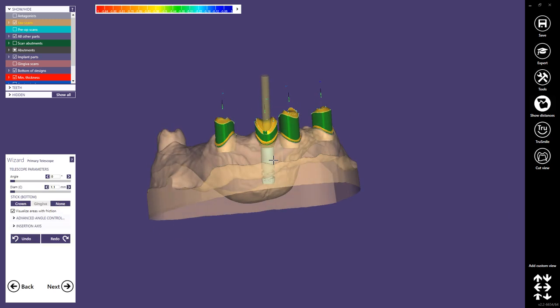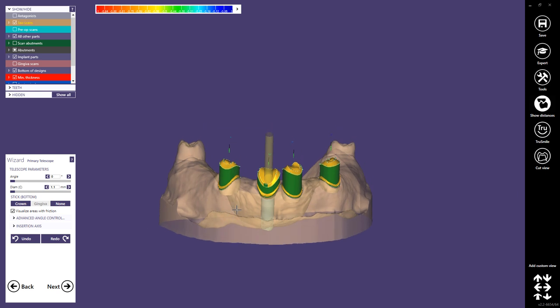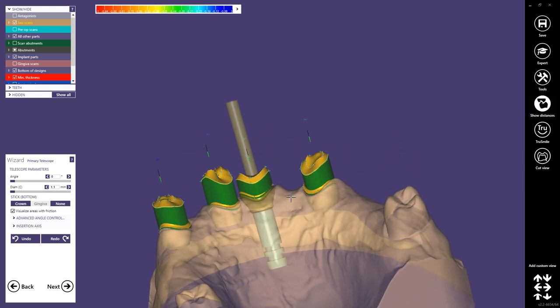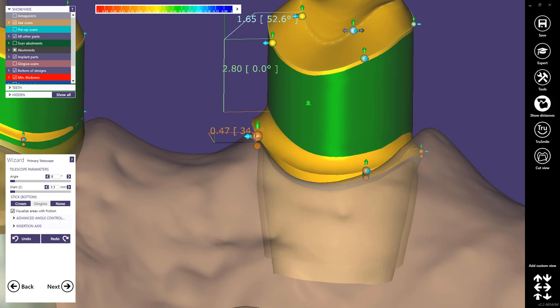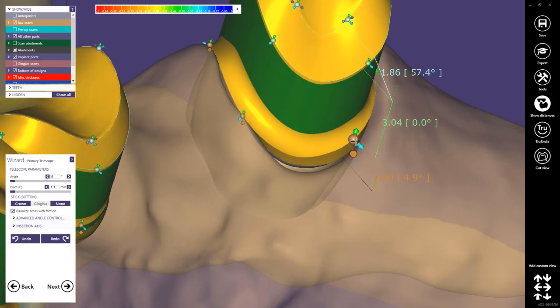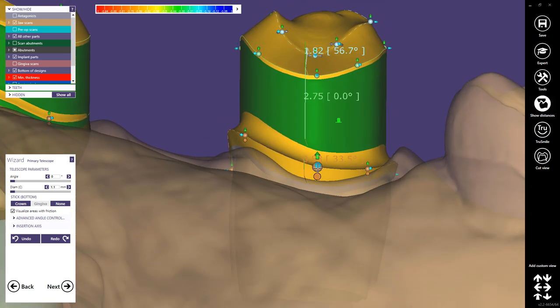Now we will start with the design of the telescopic crowns. You might need some practice to design them quickly, as there are so many features, buttons, and options. I will try to show how it can be done quickly. Let's start with the borders. I start first with one crown and simply adjust the borders so they are a little bit higher than the gingiva border. Some people don't create borders at all and design them as thin as possible.